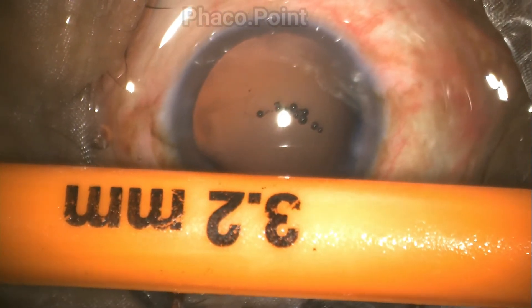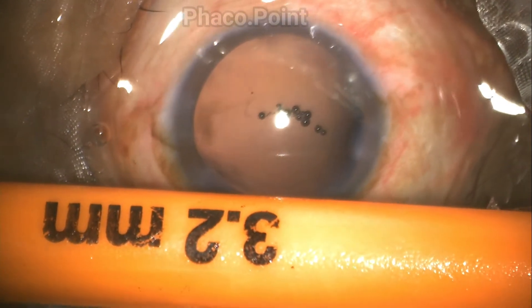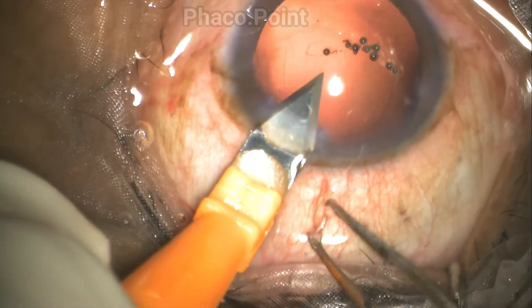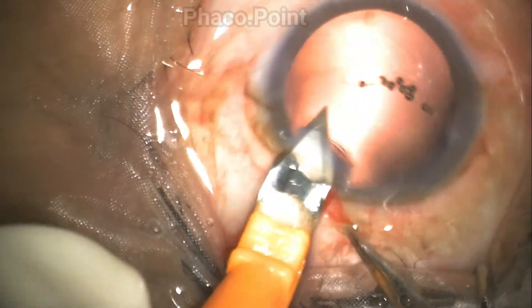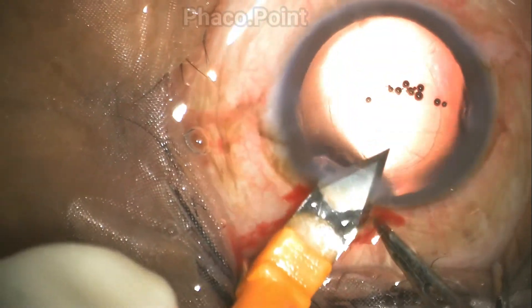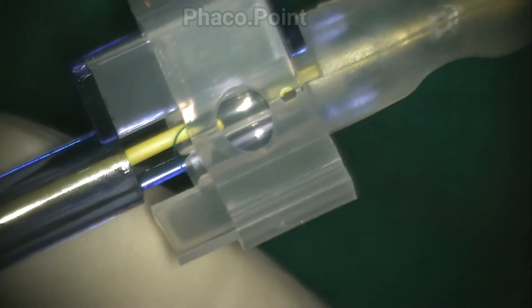The regular 2.8mm incision would not suffice. The next best option is a 3.2mm keratome, and here is how we enlarge the incision to about 3.4 or 3.6mm. Whilst giving counter pressure with the limbus forceps, the 3.2 keratome is introduced into the existing 2.8 incision, moved all the way in and out, and a few slicing motions on either or both sides should give you an adequate incision.